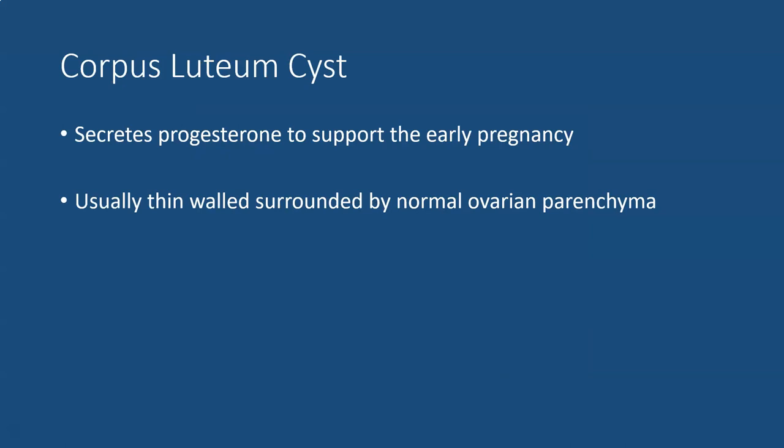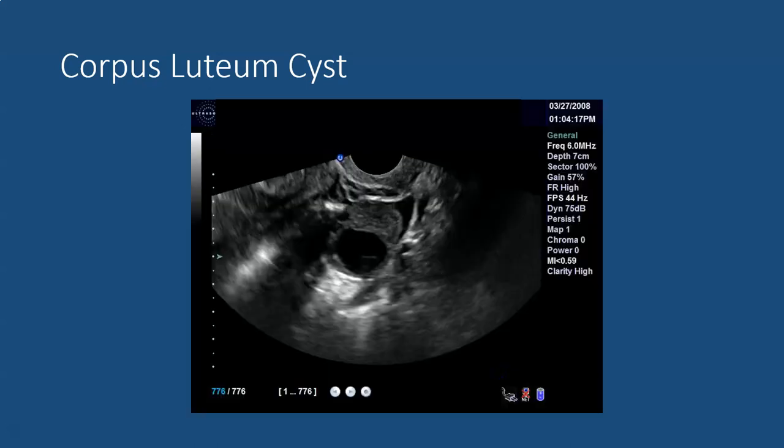Corpus luteal cysts are very common, also called corpus luteum cysts. They're seen within the ovary and are usually fairly simple in appearance, meaning they don't have internal echoes. They secrete progesterone early on in the pregnancy to support it. This is a corpus luteum cyst in the left ovary with a small amount of free fluid, which is normal and physiologic.